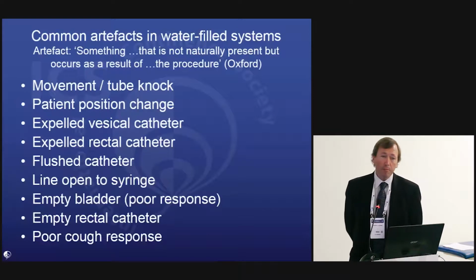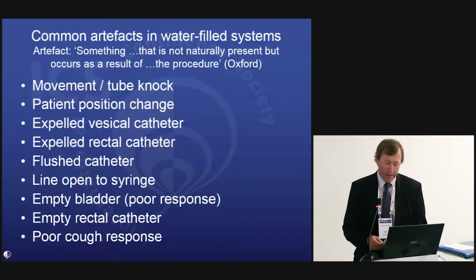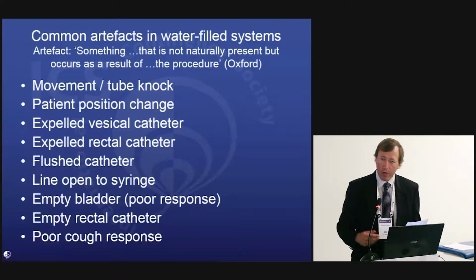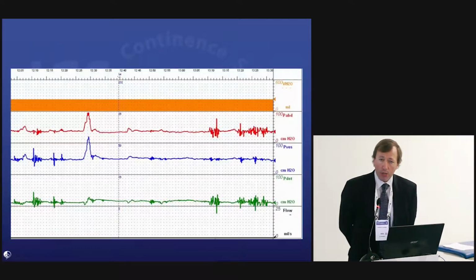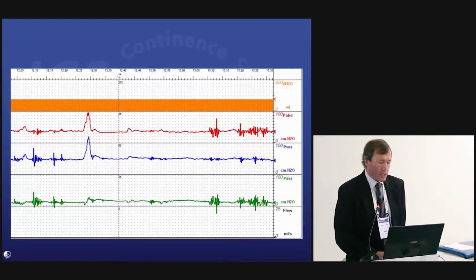So these are not patient pressures. They are not signals within the patient. They are a function of the system or the machine. And we need to recognize them, and we'll deal quickly with these 9 so that it is possible to deal with them as well. We'll look at the main features of each, and we'll discuss how to remedy in the test. So first of all here, what is going on in this slide?